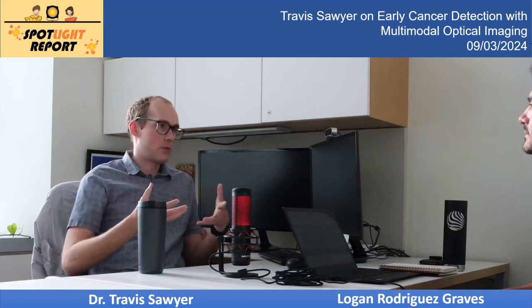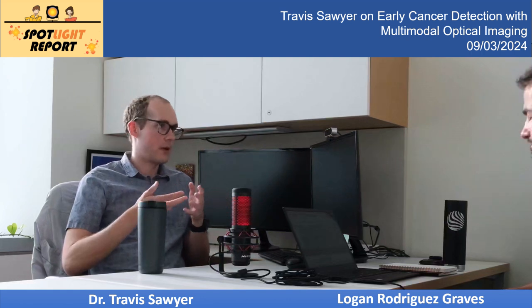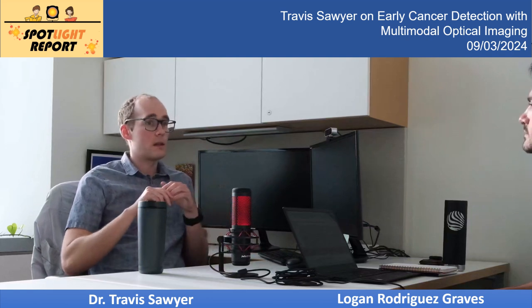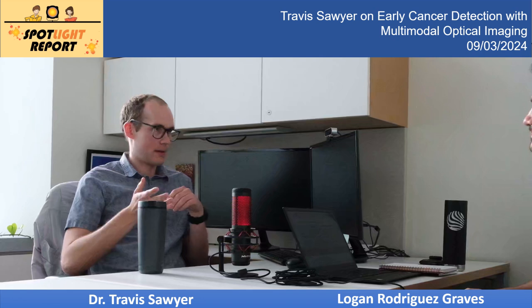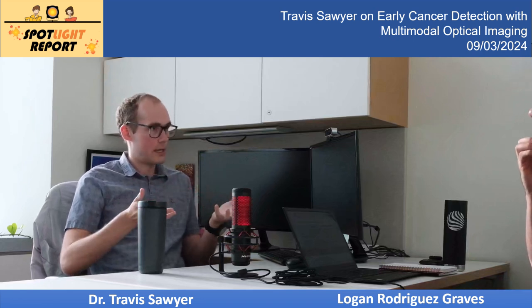Advantages of that are that, again, it's great for microstructure. Any difference in refractive index produces a Fresnel reflection. You have Mie and Rayleigh scattering from cells, nuclei, stuff like that. What it's not very good at, essentially it's non-specific: you're going to get scattering off of whatever cell there is. Doesn't matter if it's a cancer cell, doesn't matter if it's a healthy cell. So you do have to look at the larger picture. A lot of it is qualitative.